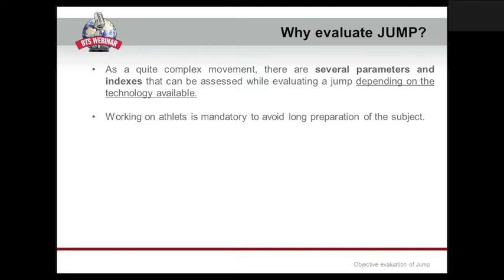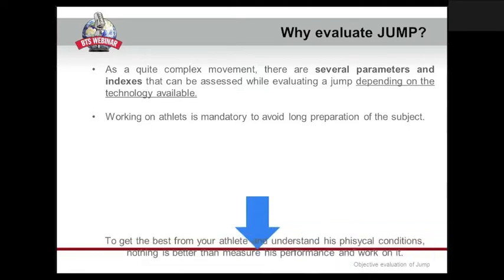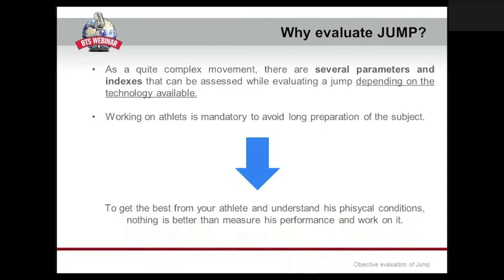Of course, we have to think that working in the sport field leads us to avoid very long preparation of the subject. So it needs to be something very quick to be applied to the athlete. So to get the best from your athlete and understand his physical condition, nothing is better than measuring his performance and working on it. So we measure the performance, and then after we can do all the analysis that we want. But we want the analysis to be very quick and fast, not to make the athlete lose time to train.